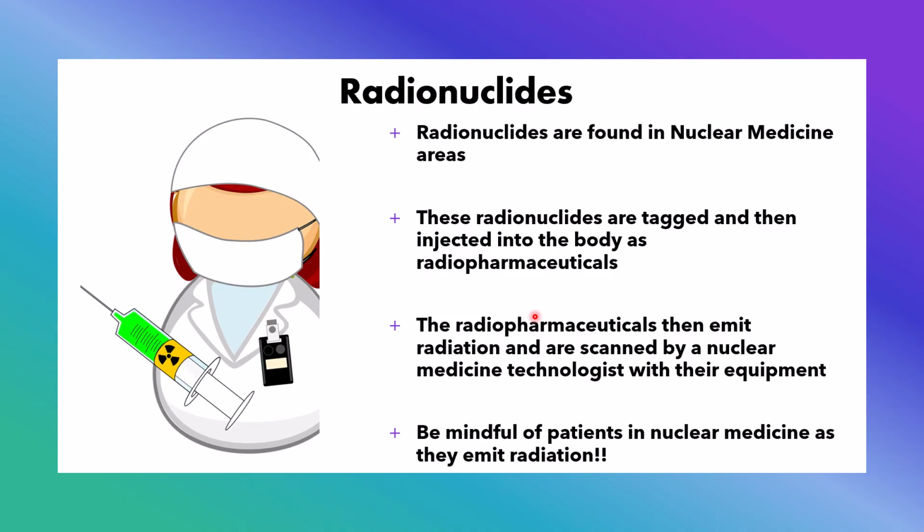The pharmaceutical decides that whatever you're hooking it to, you can do a lung scan or a bone scan. So it's the radiopharmaceutical that you hook it to that takes the radionuclide to that body part. Be mindful of patients in nuclear medicine as they are emitting radiation. A low level, but the radiation is inside of them, and then you use a camera to detect it. Whereas we're emitting the X-rays externally and using a plate to detect the X-rays.